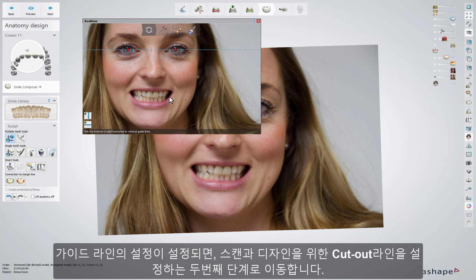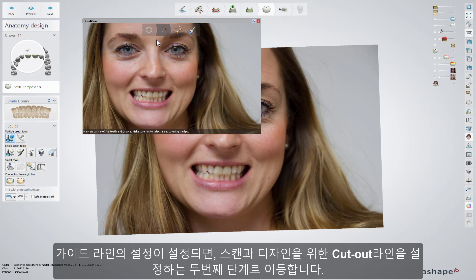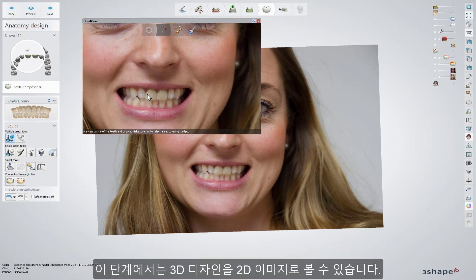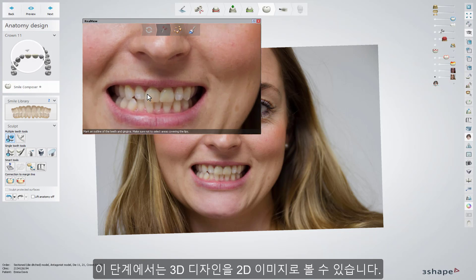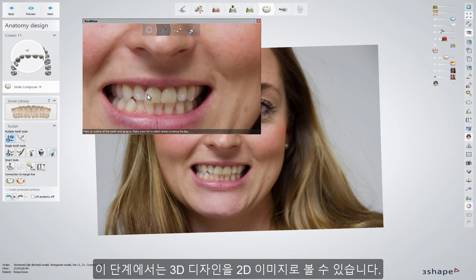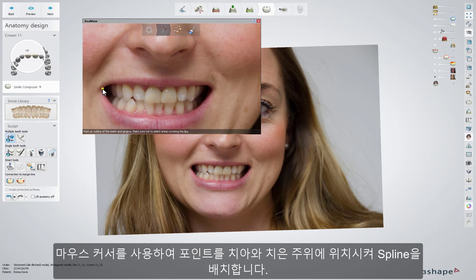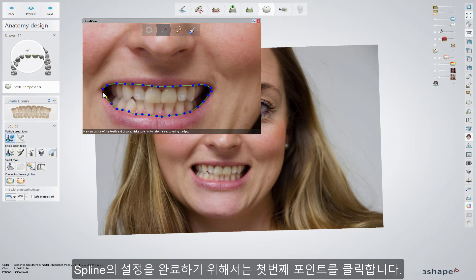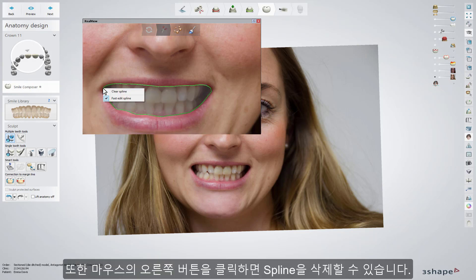When the guidelines have been set, you can move to the second step, which is setting the cut-out line for scan and design. This enables your 3D design to be seen as a 2D image. Click on the second step and place the spline around the teeth and gingiva by placing the control points with the cursor. To close the spline, click on the first point. Right-clicking on the spline gives the option to clear it.